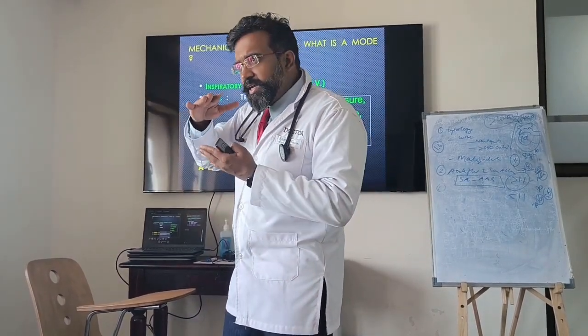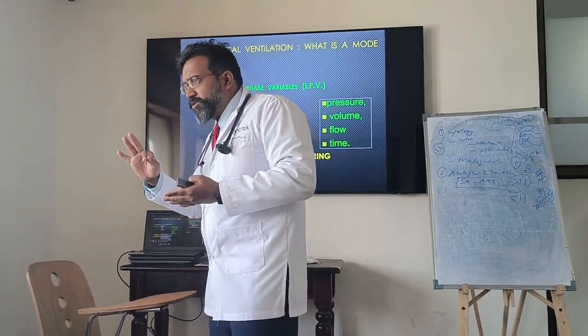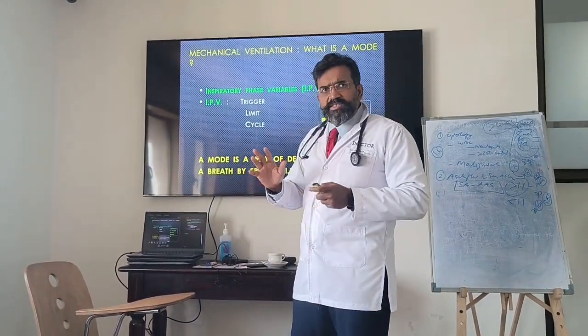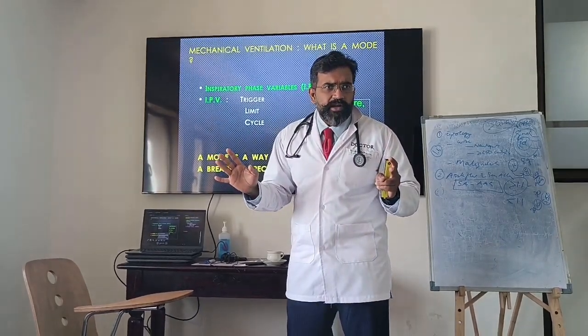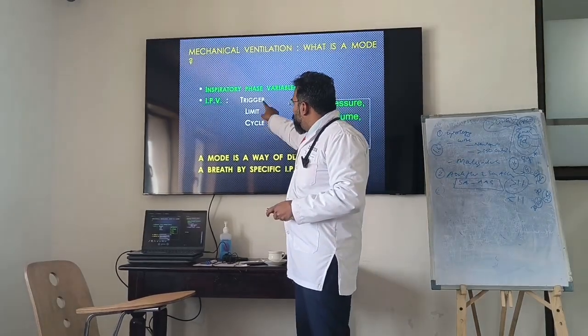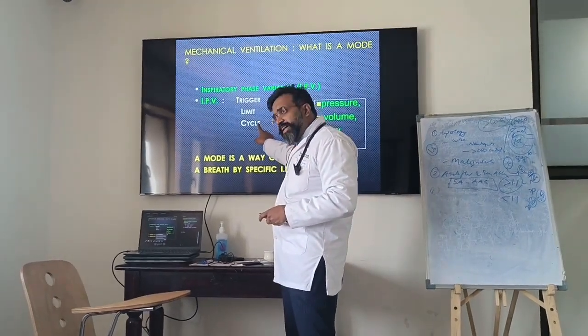Okay, and for that you understand, get the basics right. For that, these terminologies, trigger, limit, and cycle is something that we talk. A mode is just a way of delivering a breath, and that way is described by these things. Now, these are the things that you are setting.